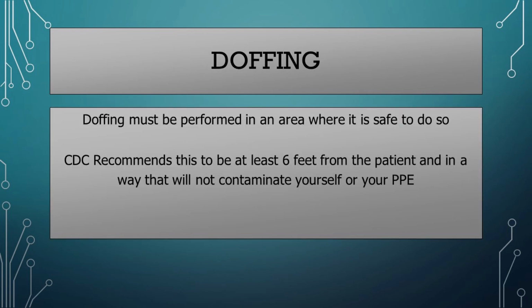Doffing must be performed in a location where it's safe to do so and in a manner that reduces the potential for self-contamination from contaminated PPE. The CDC recommends that you be at least 6 feet away from the patient and in a way that will not contaminate yourself or your PPE.